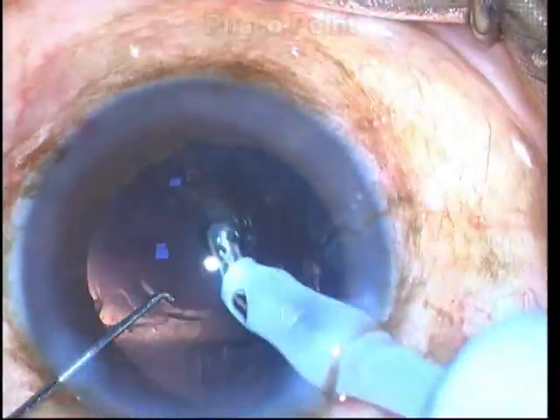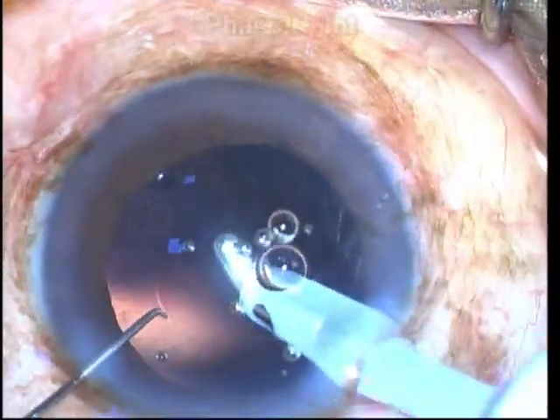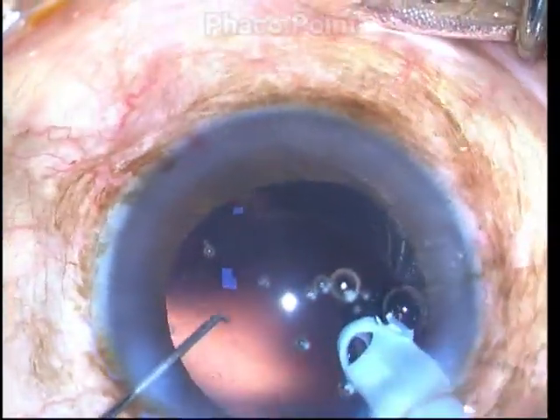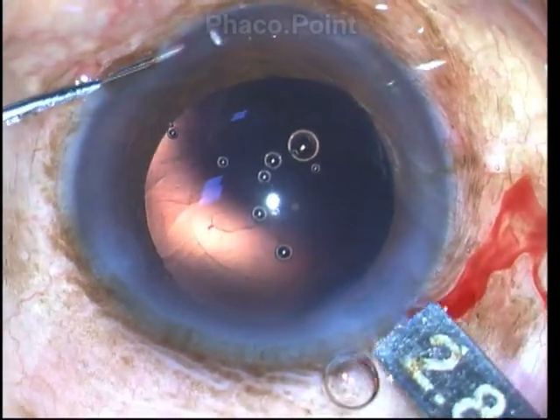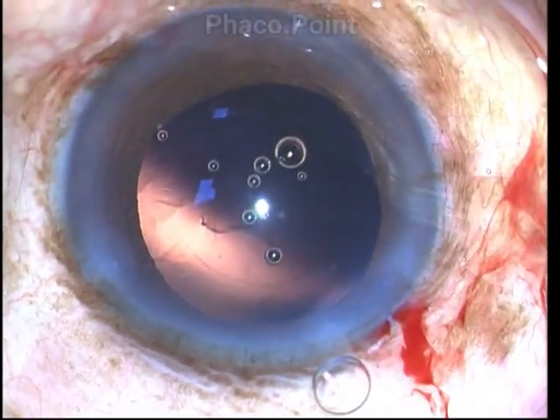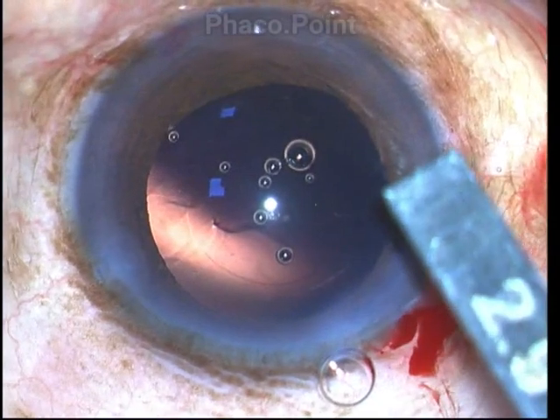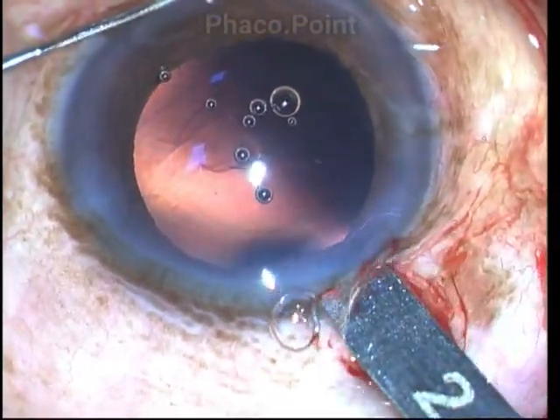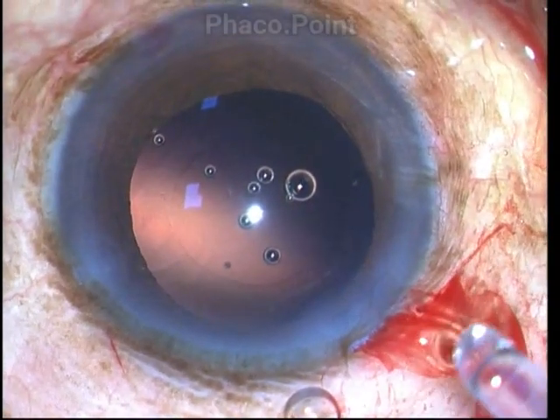After completing the cortical wash-up and just before the implantation of the intraocular lens, the size of the incision is measured once again to see if there is any enlargement that has occurred during phacoemulsification and coaxial irrigation-aspiration. The 2.8 mm caliper fits snugly. When I attempt to pass the 2.9 mm caliper, I find that there is no extension of this clear corneal incision at all.